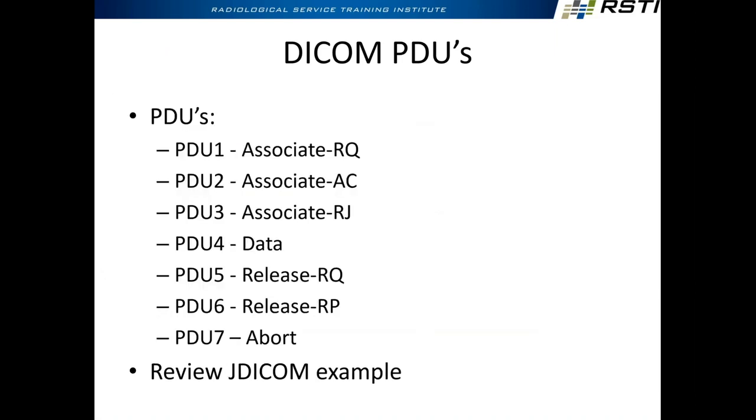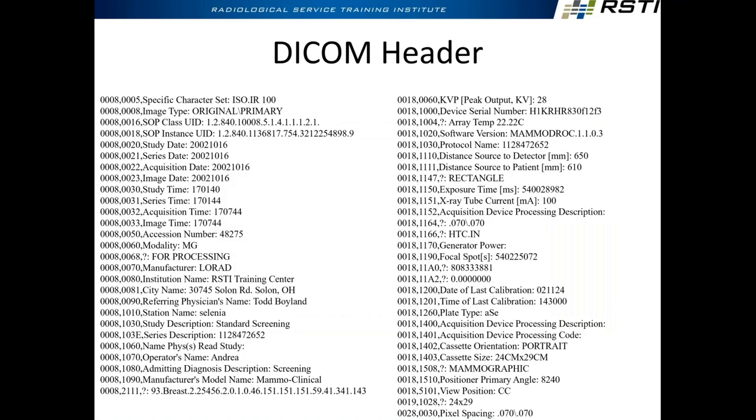So really, if you take nothing else away from this, that PDU thing is important. Because when you go to your PACS or your workstation, your modality, or your emulator, the logs may look a little bit different, but they're all going to be in that format. If you can understand those PDUs in the emulators, it makes it way easier.